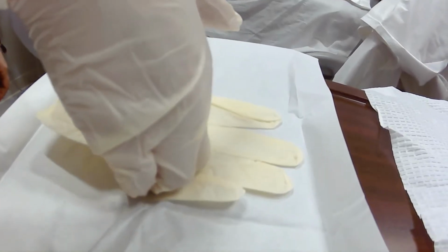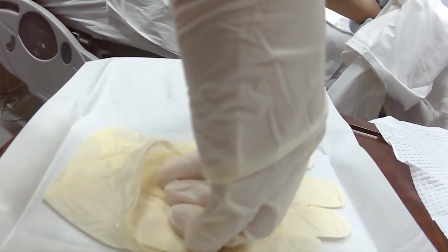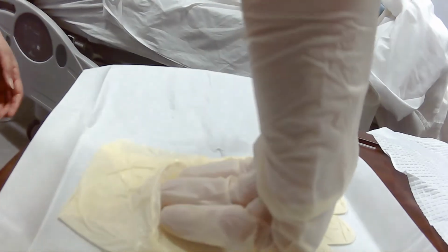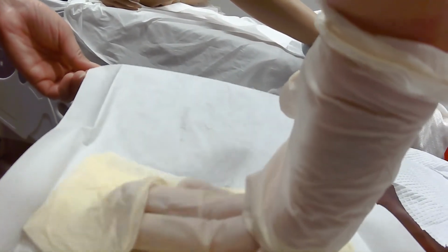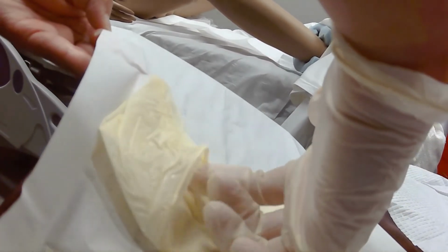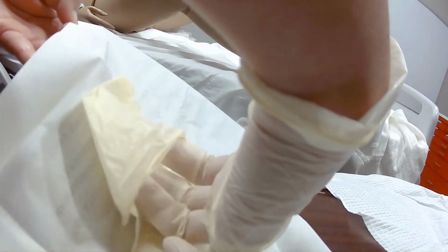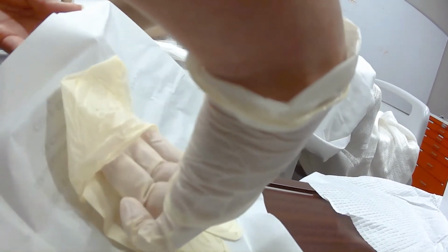So to do that, I am going to carefully, using one of my fingers, I like to separate the cuff here so that way I can slip my fingers through that inner cuff. It forms a pocket. If your gloves are really stuck on there, you can lift the wrapper from the bottom so that way your gloves don't slide out of the wrapper, because then you're going to contaminate them and then you have to start over.